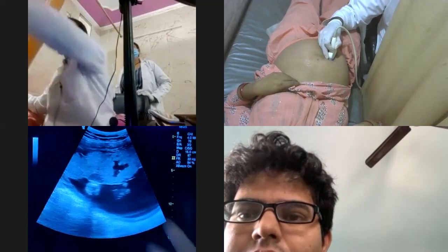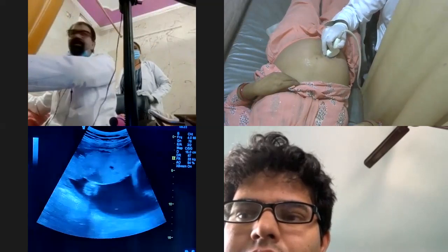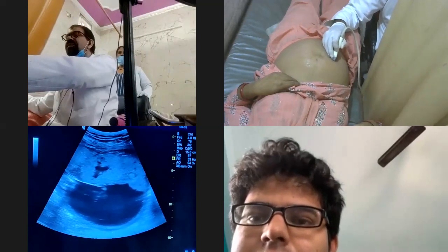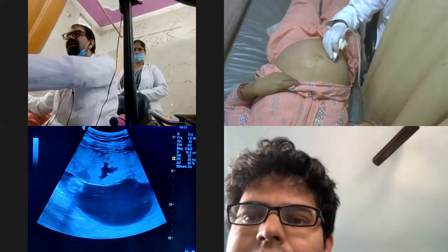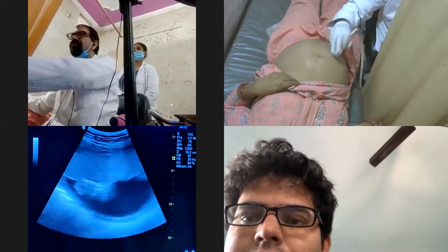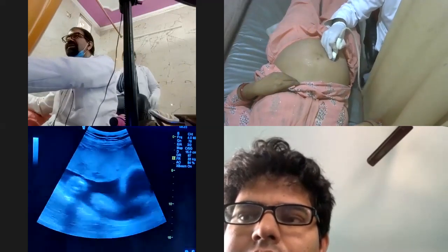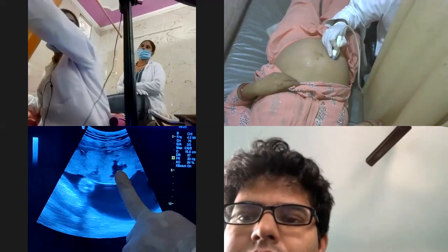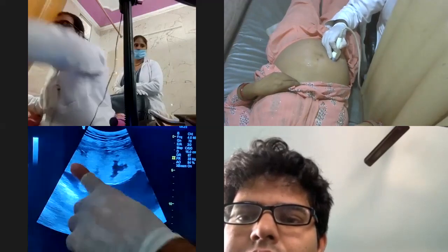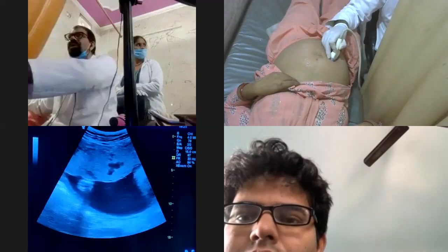But of course, we are having some lakes. These are the placental lakes over there, right? Yes, sir. A couple of placental lakes are accepted, but the question is, if I see very prominent placental lakes, what can the case be? Recall your theory, which we have taken with you. If there are multiple placental lakes, like I see one placental lake over here, if I see a bunch of placental lakes, one here, another here, third here, so if I see many placental lakes in a 30-week fetus, what can that be?